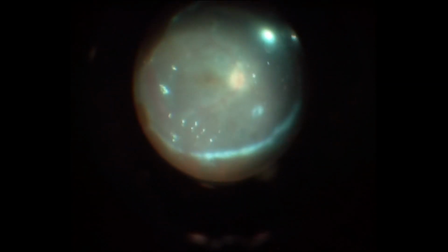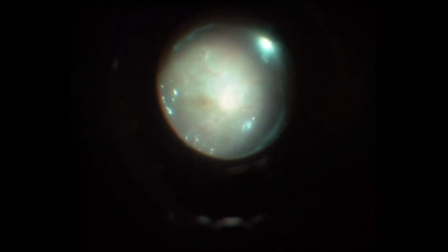Even despite performing a large inferior retinectomy, the retina was still stiff and was folding over the superior retina. To counter this problem, the infusion was again switched on. A 360 degrees relaxing retinectomy was completed. This was followed by flattening the retina using PFCL liquid.